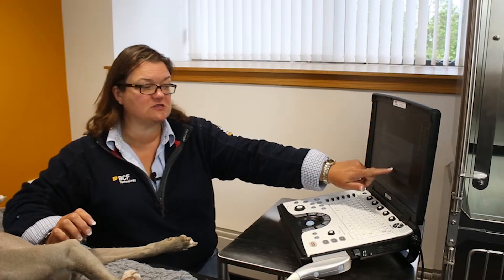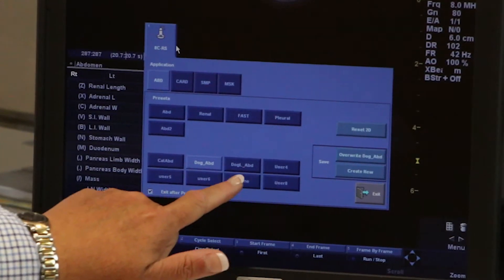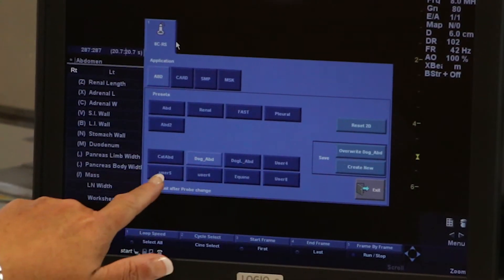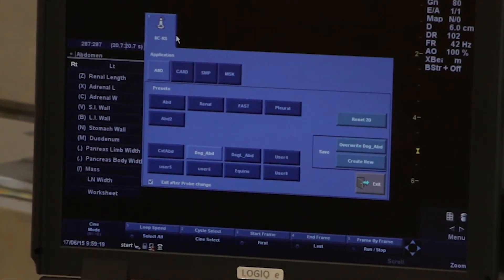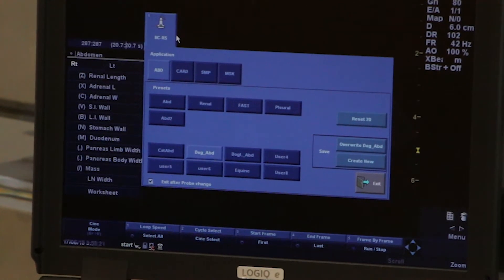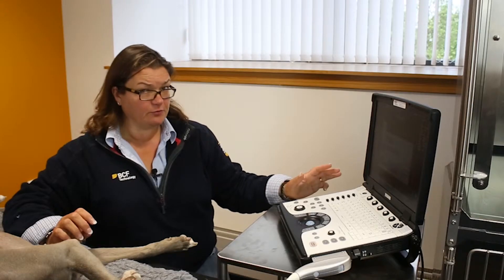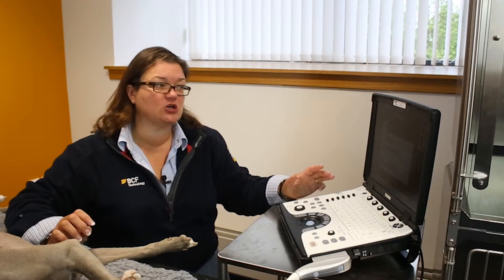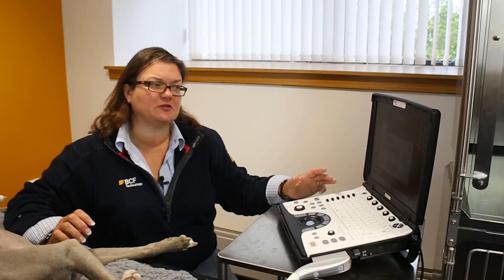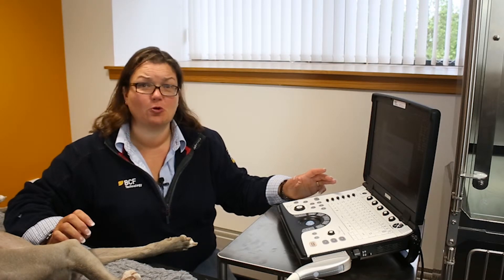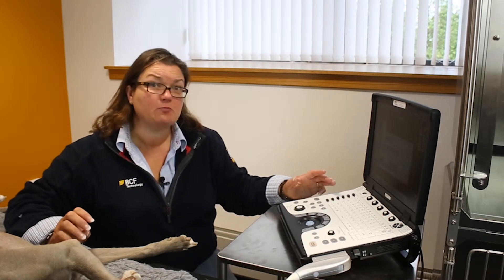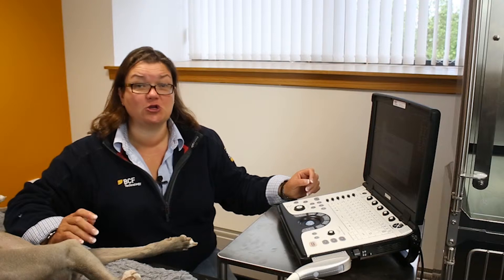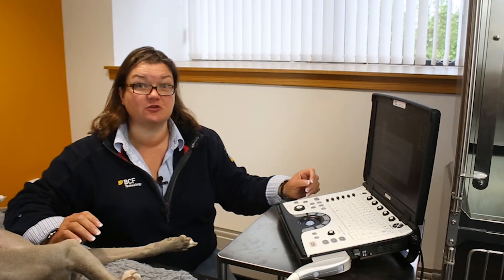You'll notice that there will be some spare presets — user 4, 5, 6 and 8 on this particular machine. Those are available for you to create your own presets, so you can adjust and personalise the way you see your image and keep those little adjustments permanent, so that when you turn on the machine your preset is there for you to use.